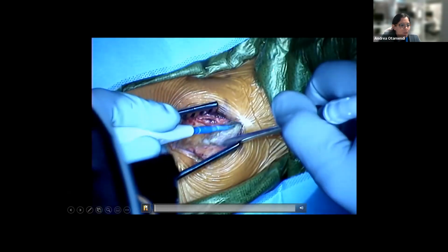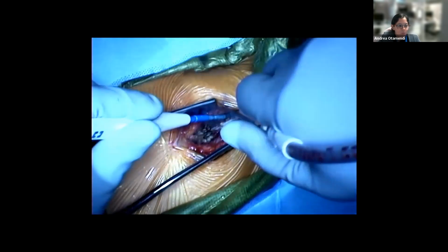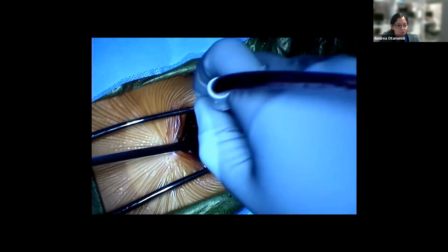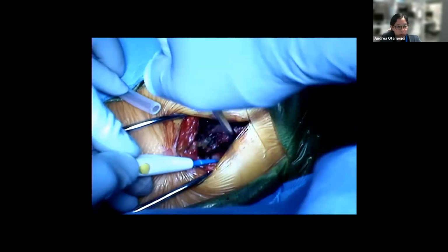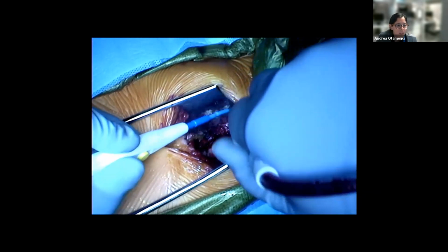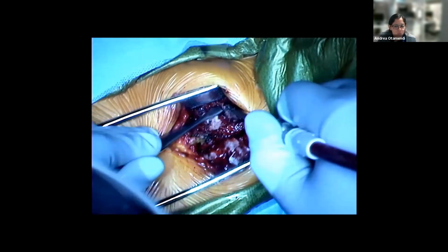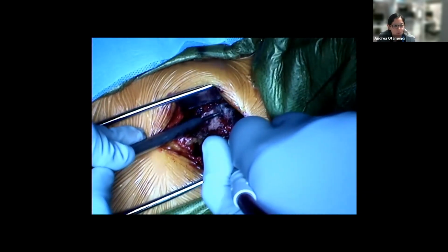And here, the patient was taken to the OR and placed in a prone position. The subperiosteal dissection was performed. The location of C5 and C6 were confirmed by X-rays, and MEPs and SSEPs were obtained at baseline. Then Dr. Akinduro started working on the drilling of the C5 and C6 facet joints with the drill, and then also started the placement of the screws.